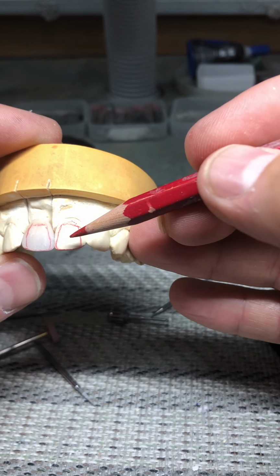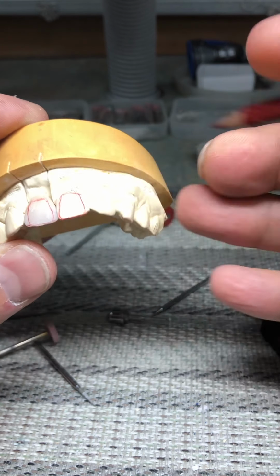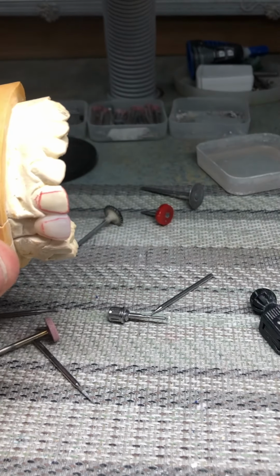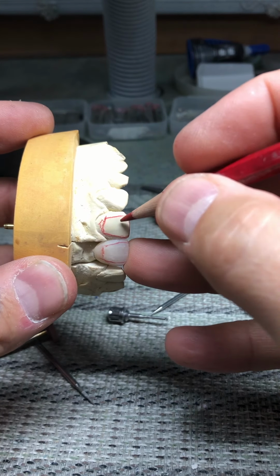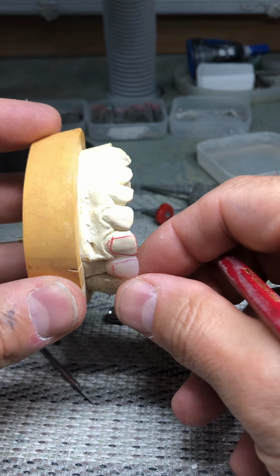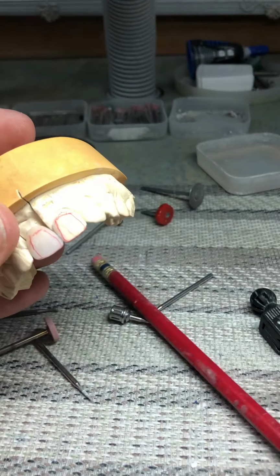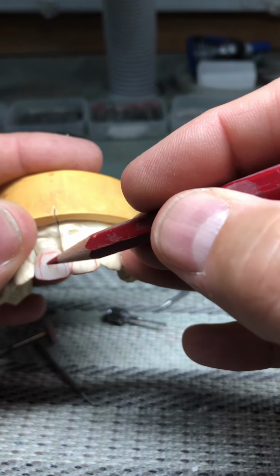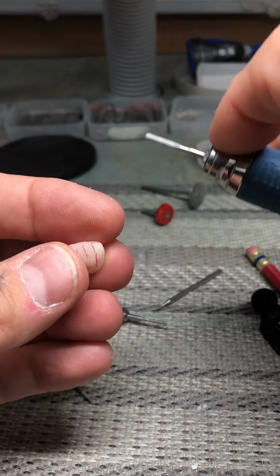The surface texture of this tooth is hard to discern. But if I allow the light to shine across the surface, I can see that there is a mamelon pretty evident right about here. I think you can see that on the video. So I'm going to just try to replicate it. It's very subtle, so it's not a strong surface.